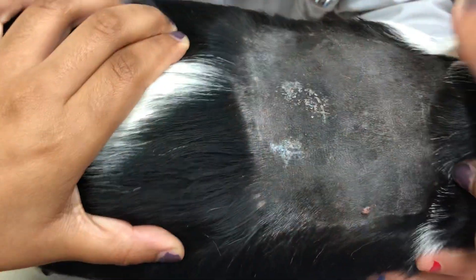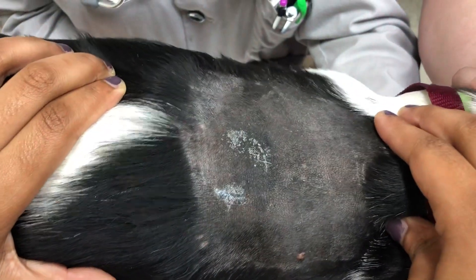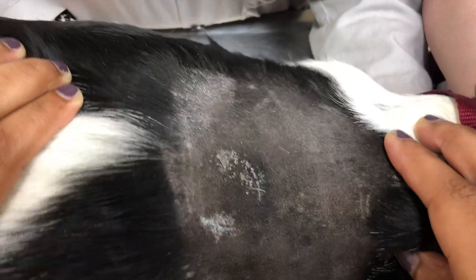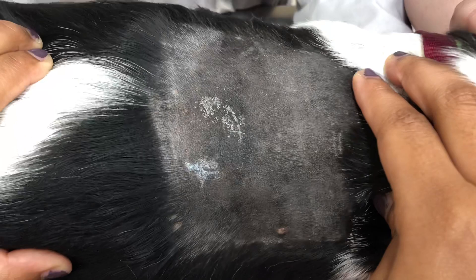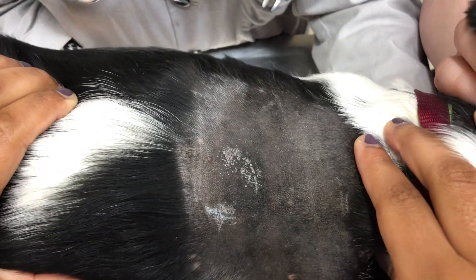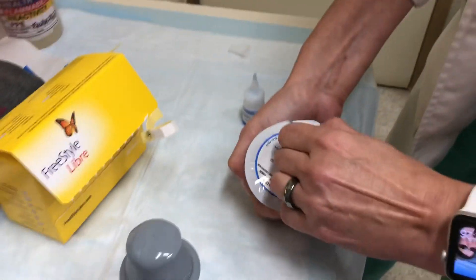This is Buddy. We clipped and cleaned the side of the application site, right at and behind his shoulder blades, then alcohol it off. Now we have to wait for the alcohol to dry, which takes a few minutes — probably the longest part of anything we're doing here.